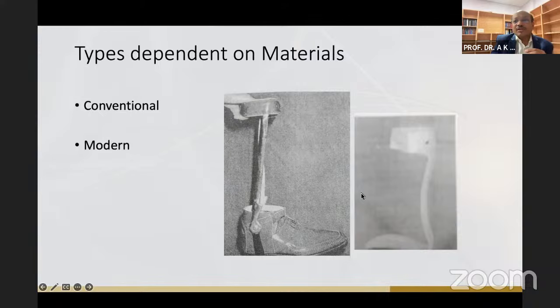This is an aluminium bar, a double bar. And this is the modern thermoplastic orthosis. See, this is a posterior leg component, a leg shell actually, and this is the foot component. There is no joint at all. And this is a cuff band. So this is a classical thermoplastic modern orthosis.